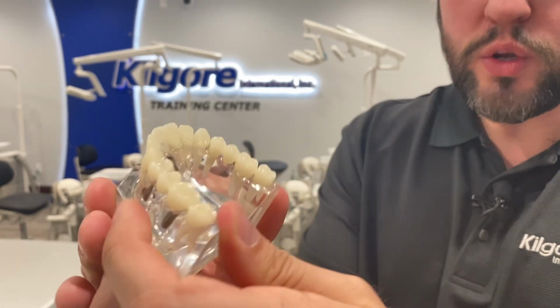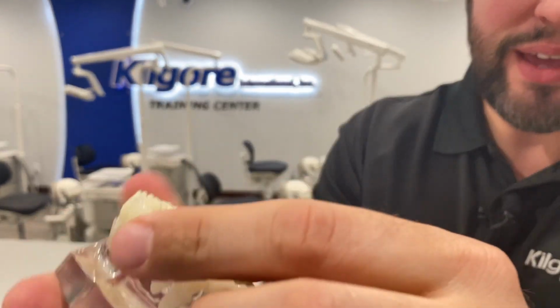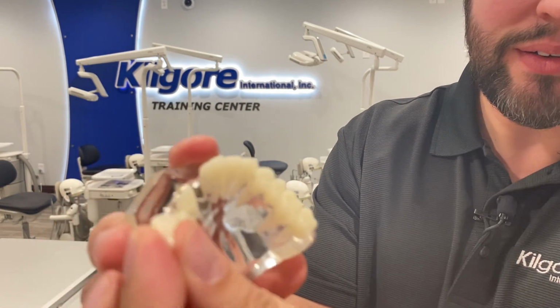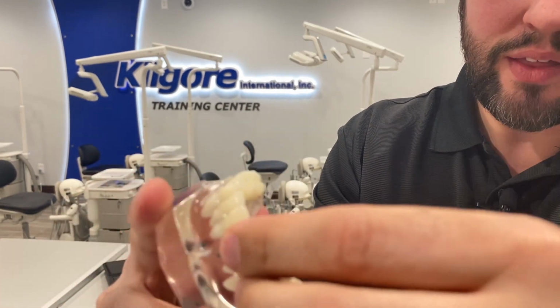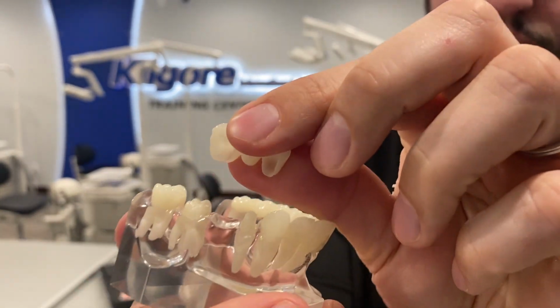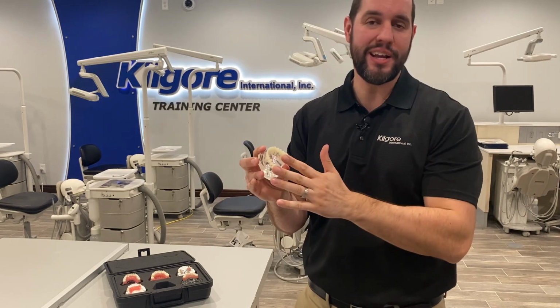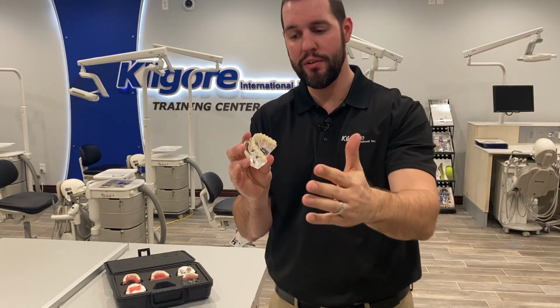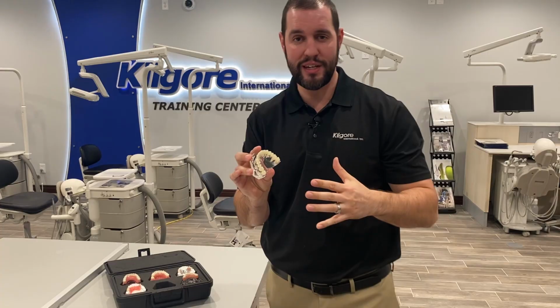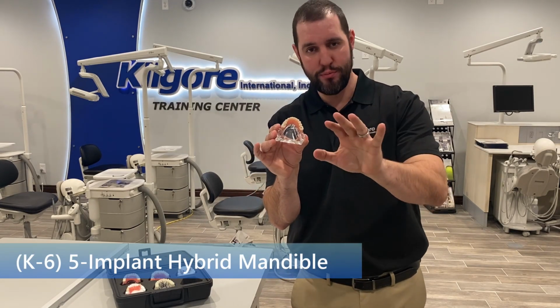So what I do want to show you here is, of course, all your options. You have an implant supported bridge. You have a single tooth implant. And then you have a natural bridge. So it gets everyday conversations that you're having with your patient. And if they're deciding whether to do an implant or a bridge, now they can make an educated decision based on that, based on your consult, and based on a very tangible model about what's the best thing they need to do. All right, this is our case 6, and this is our screw-retained hybrid denture.